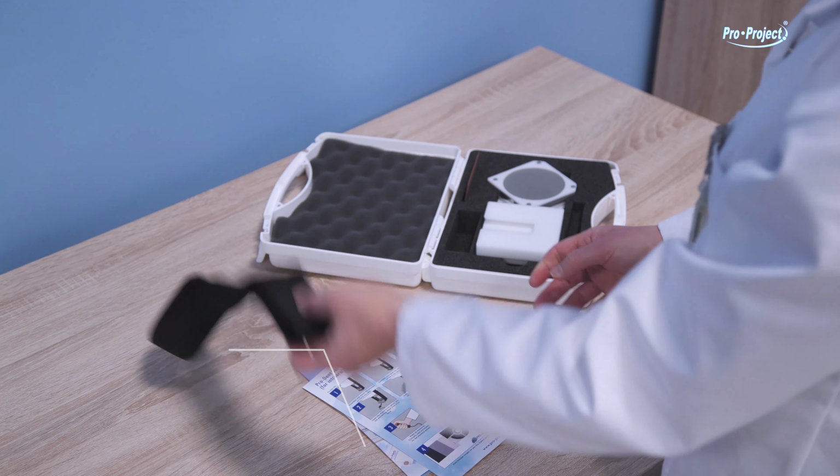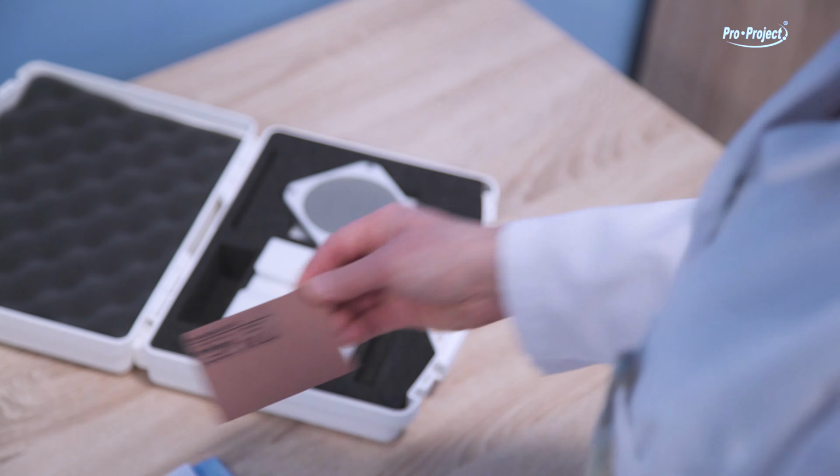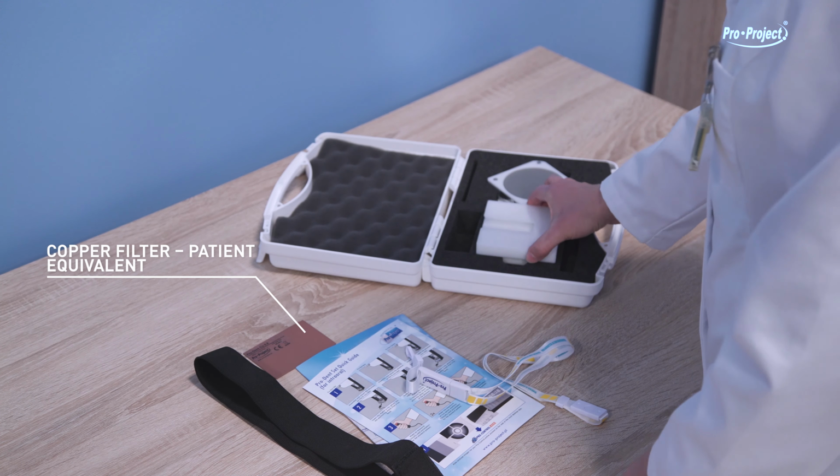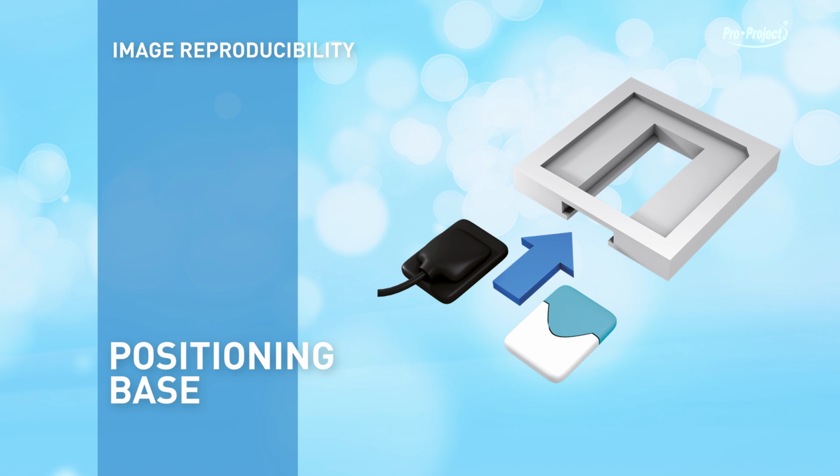Mounting band with Velcro. Copper filter, patient equivalent. Positioning base with place for an analog film or digital sensor.